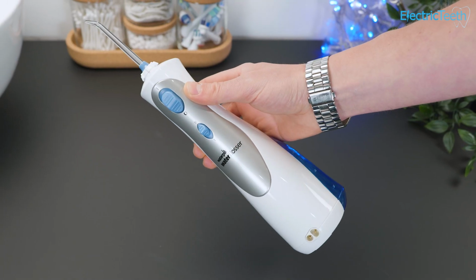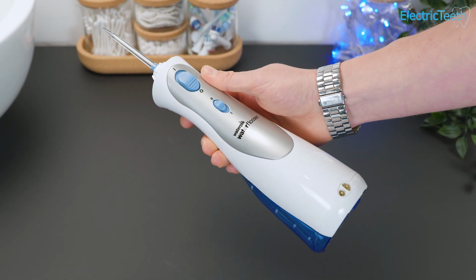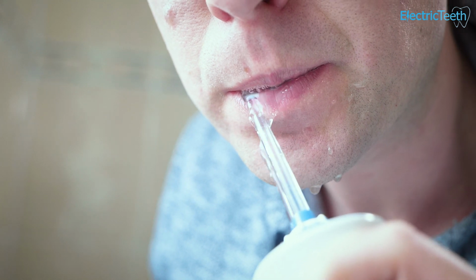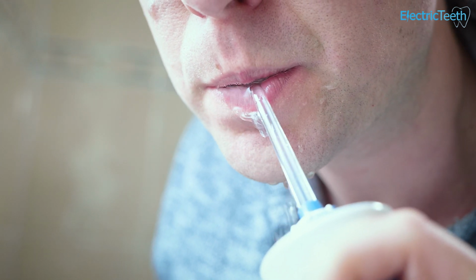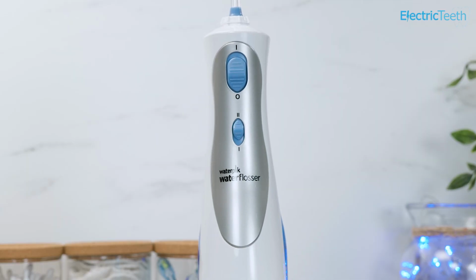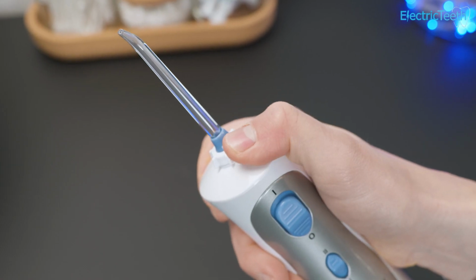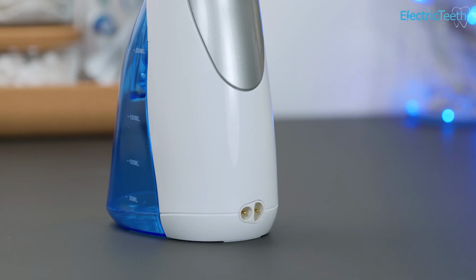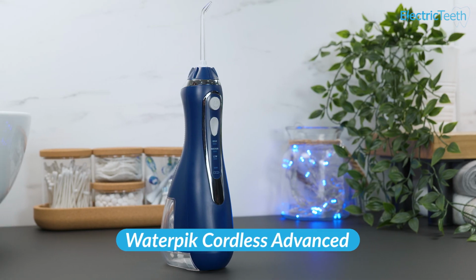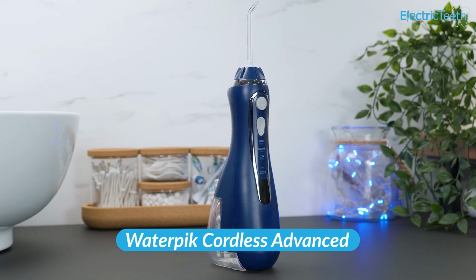So I'm going to jump straight in and give you my overall verdict on the Waterpik Cordless Plus. The Cordless Plus from Waterpik is satisfactory. It does the job it was designed to do. The lack of a battery status indicator is rather frustrating. You don't know when it needs charging or when a charge is complete. The nozzle rotation and charging connector have been implemented better on newer models. The Cordless Advanced is one example of a water flosser I would pick in preference to the WP450.